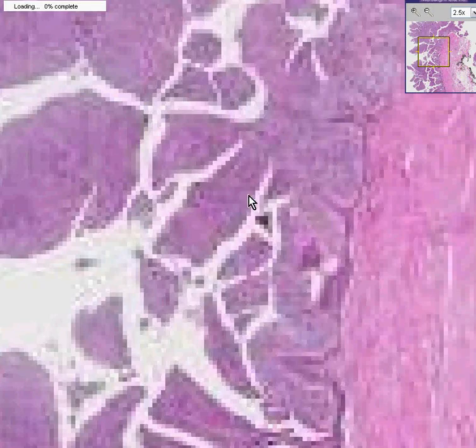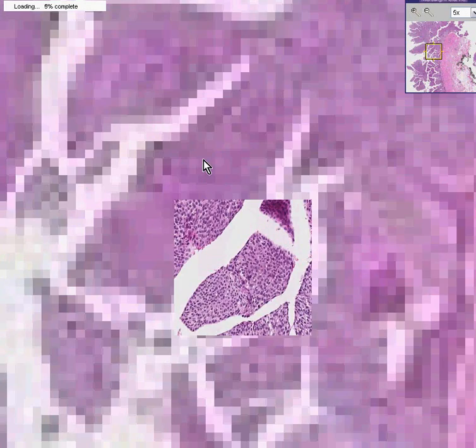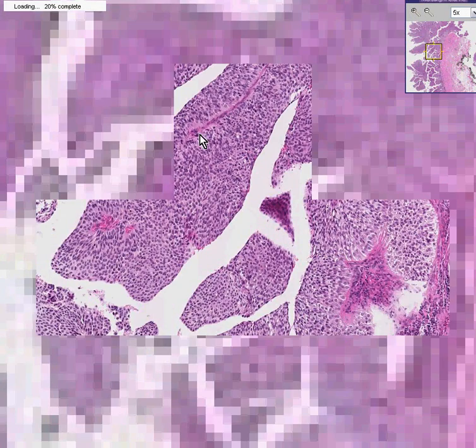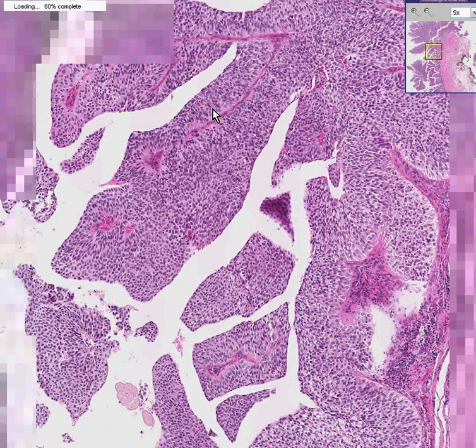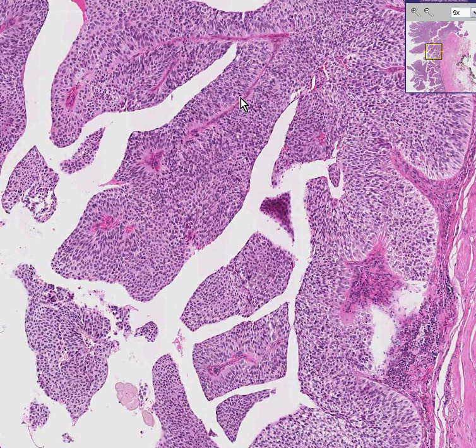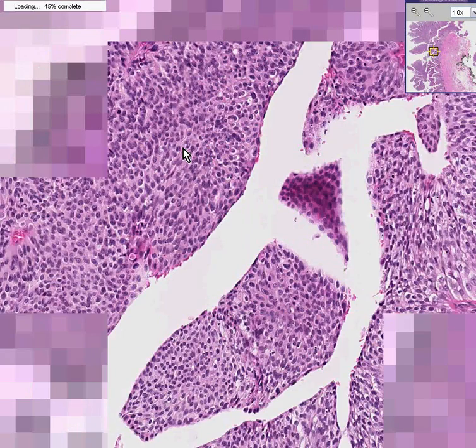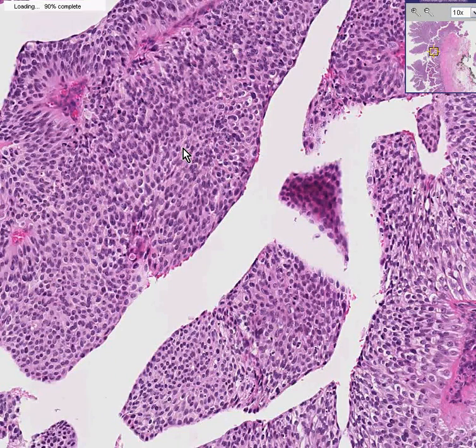You can see that even though there is a nice, thin fibrovascular core, the lining of this fibrovascular core — or the epithelial portion of the papilla — looks exactly like transitional cells. This is a transitional cell neoplasm. It's a transitional cell carcinoma.